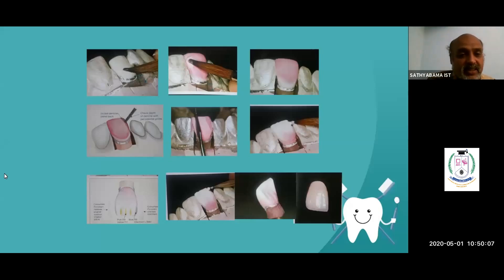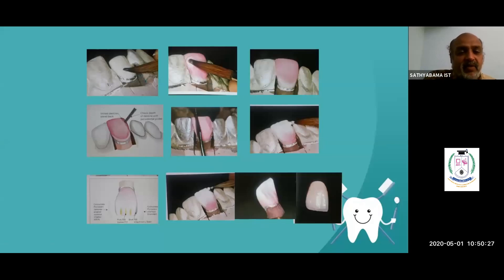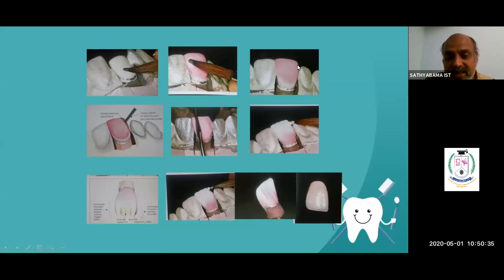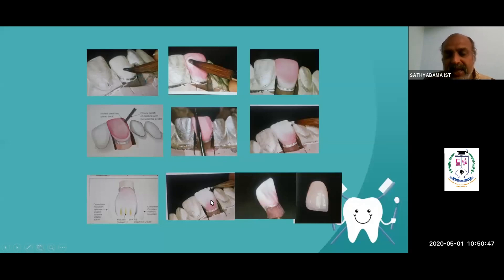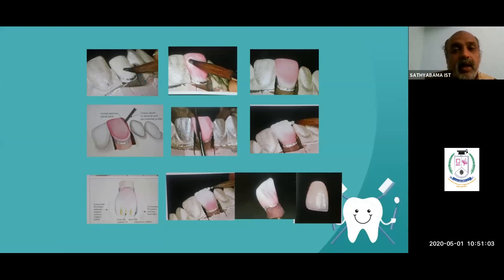In the process, we take ceramic, put it on the die, add more ceramic layers, then condense it using one of the four methods — vibration, dry brushing, whipping, or spatulation. We remove excess liquid and slowly give the morphology of a tooth, including mammalons and fissures. Once the morphology is done, we put it in the furnace for ceramic baking or ceramic firing.